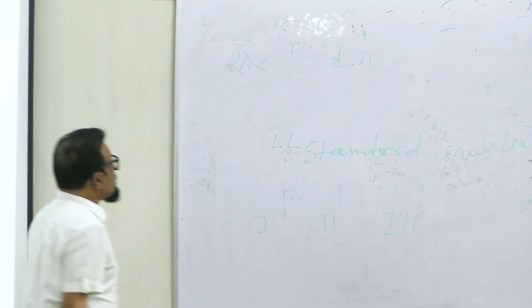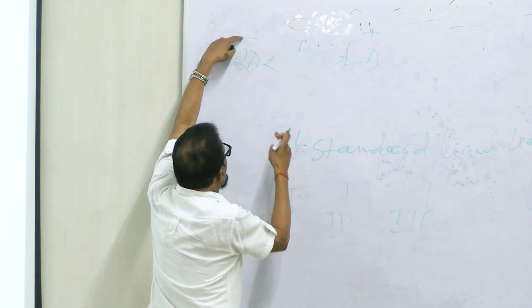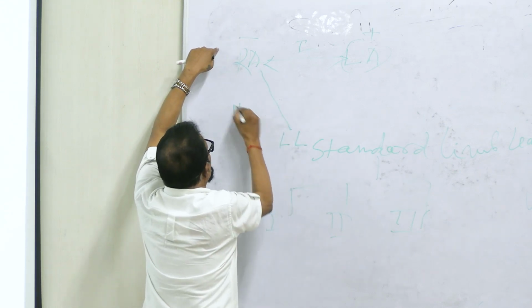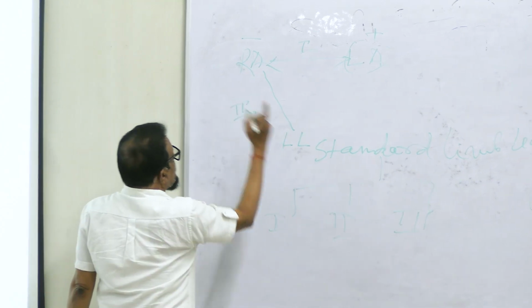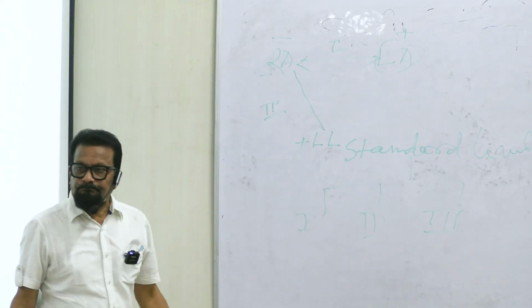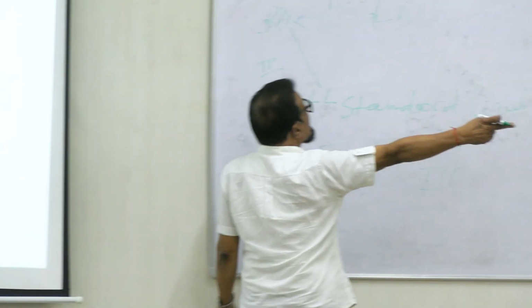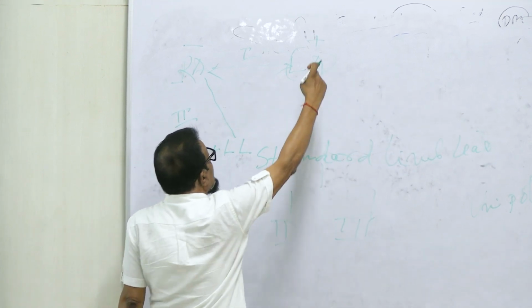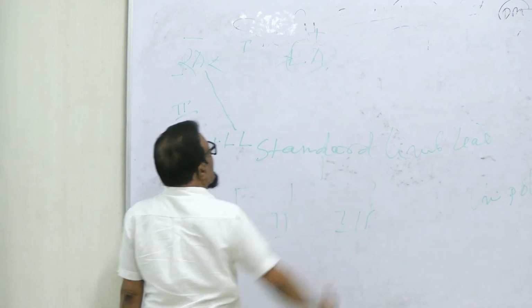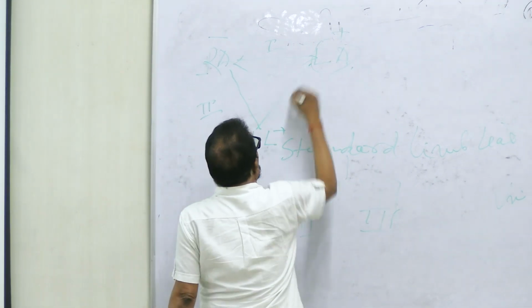And how is lead 2 formed? Lead 2 records the potential difference between the right arm and the left leg. So this is lead 2, and the positive terminal remains in the leg and the negative terminal remains in the right arm. Then lead 3 is the potential difference that we record in the electrocardiogram machine between the left arm and left leg. Here, the negative terminal remains in the left arm and the positive terminal remains in the left leg. So, this is lead 3.